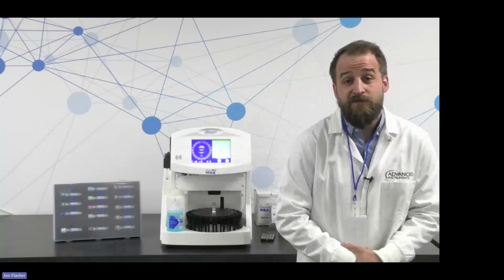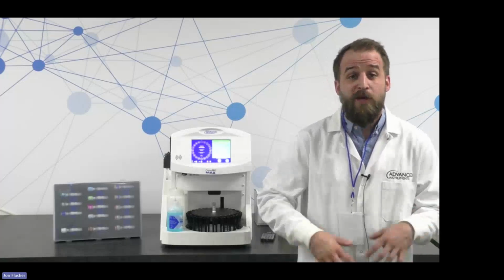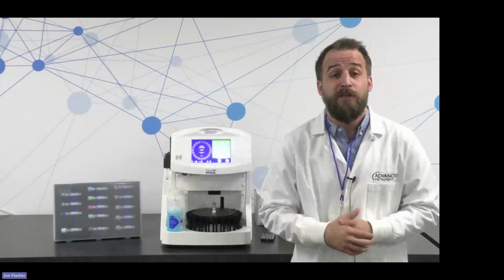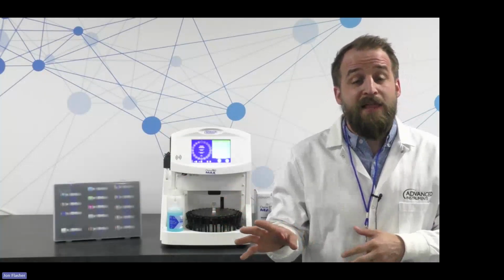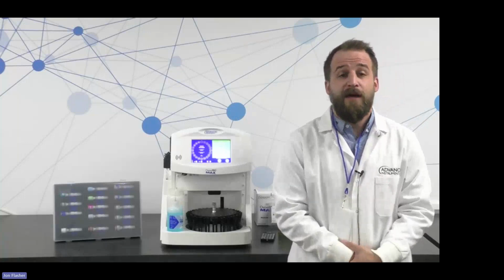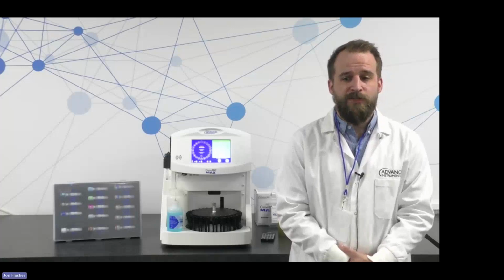So another question that was asked is, is it possible to wirelessly transfer the QC data to the advanced QC peer review program? So we actually have a web-based platform that lets you compare your QC performance to that of your peers. And yes, the OsmoPRO Max has a really cool feature that will let you actually transmit that data right to that web-based platform. So you can easily upload that without having to do it manually and compare results to your peers who are using the same instruments and quality control. Really good question.